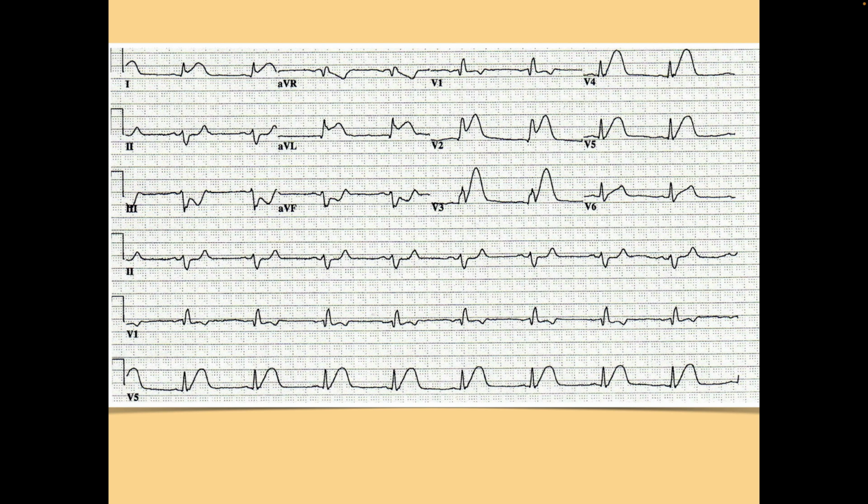However, what you have are the hyperacute T's, right? Everybody understand this is a hyperacute T, this is a hyperacute T, this is almost a hyperacute T. So we've got hyperacute T's definitely in 2 contiguous leads and maybe in 3. Now, hyperacute T's, at what point do they happen in an evolving STEMI?